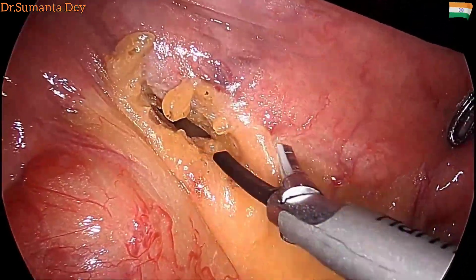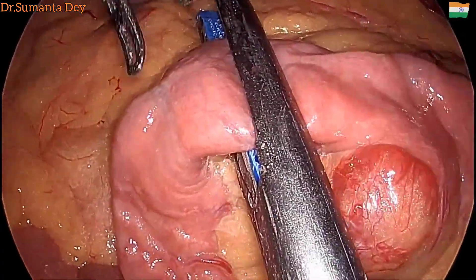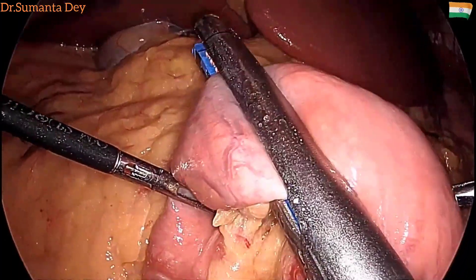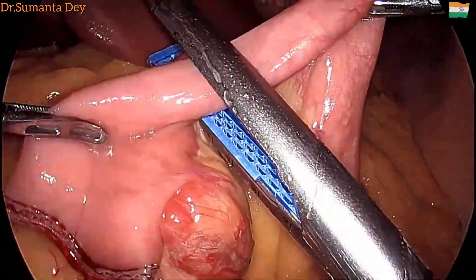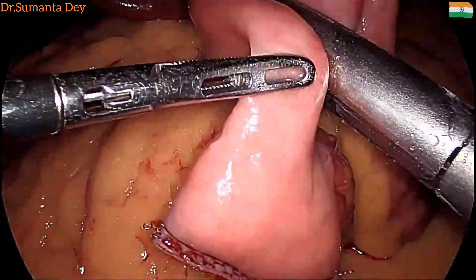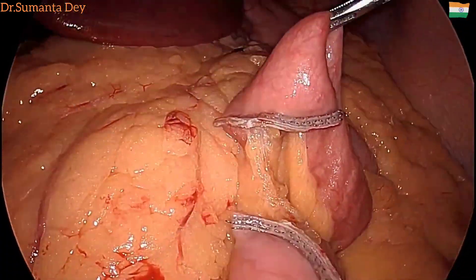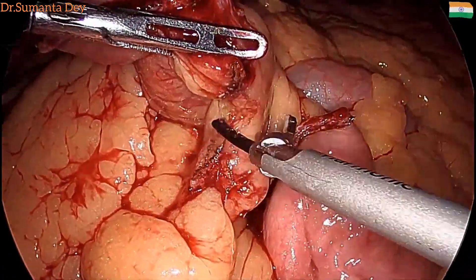You can see I'm just creating the mesenteric window, five centimeters proximal and distal to the tumor. Here I am using the 60mm blue GI endoscopic stapler. This is the proximal end and this is the distal end. After applying the stapler, wait for one minute and then you can fire, and you get a clear dry staple line.